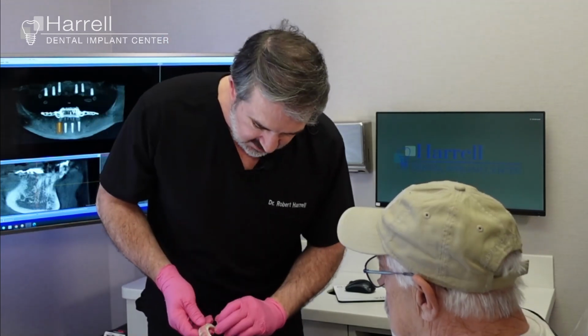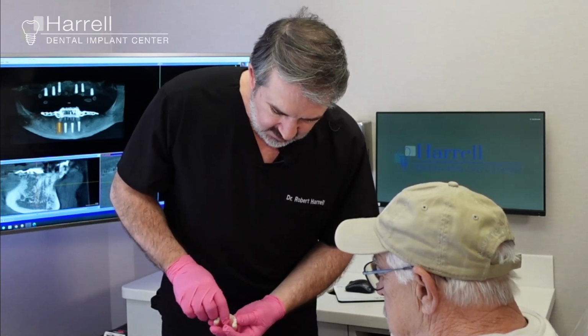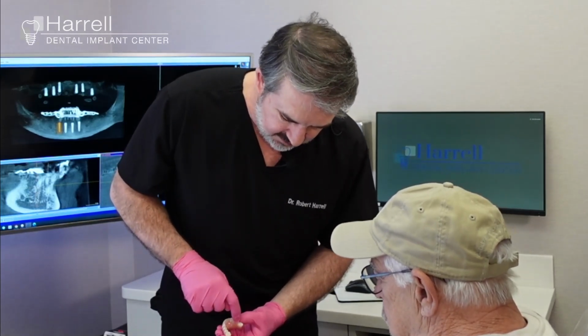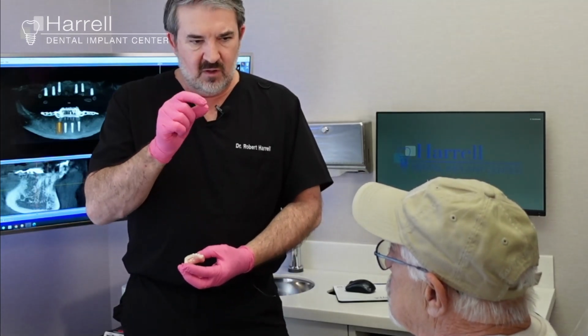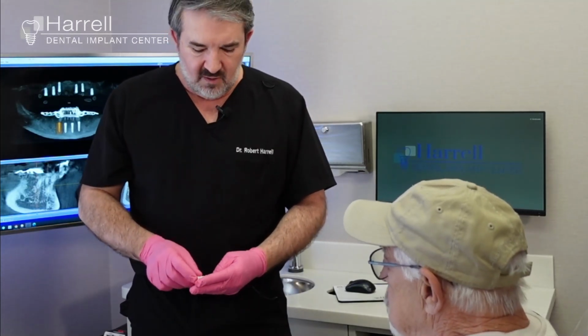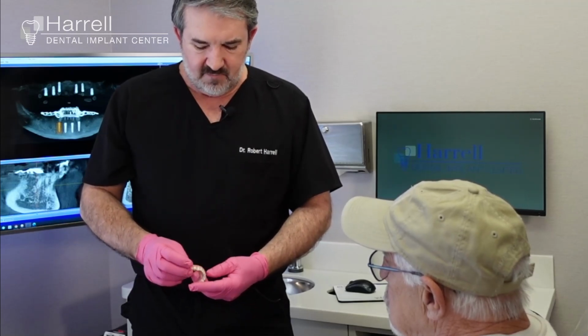zirconium, and then you can see here, this is where it sits on each individual implant. Right. And then the set screws come through the top. So it's a little screw that's about 5 millimeters long by about 2 millimeters wide. And once these suckers are in, they're in.